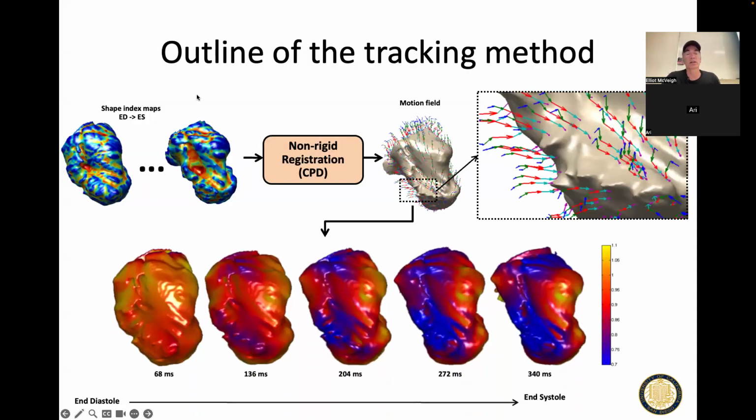So what we do in CT, we have these displacement images, right? We can use your favorite tissue tracking or feature tracking software. In video, there's lots of software written to, say, track the bikes in this field of view, and you'll see the output of that will be a box around a bike getting tracked across the field of view. Or, track the airplanes in this field of view, and it'll track airplanes.